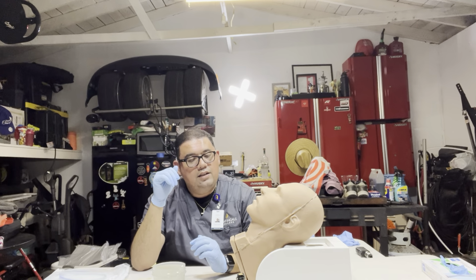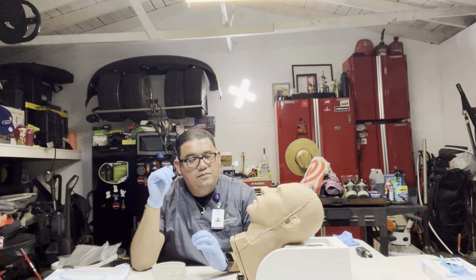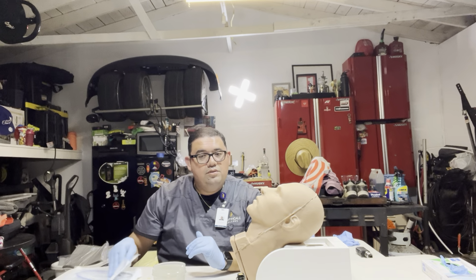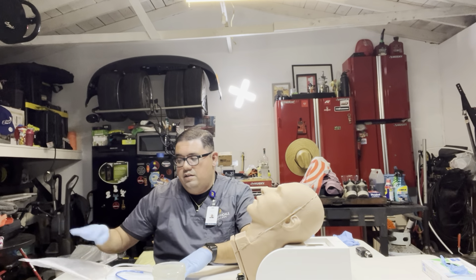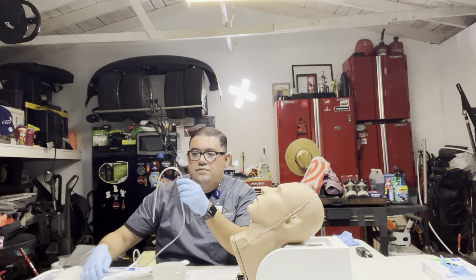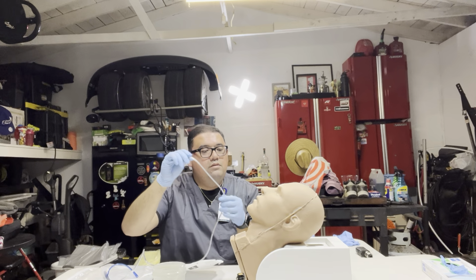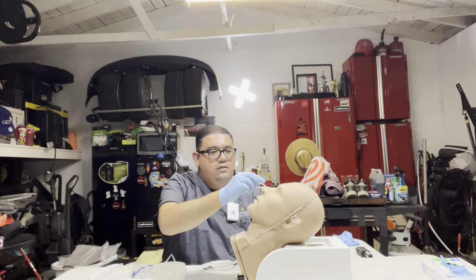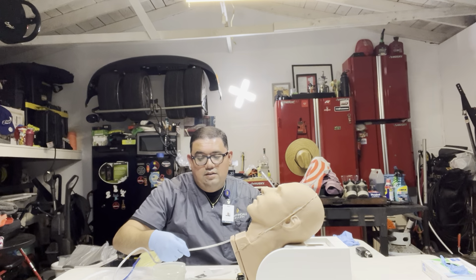I'm going to use your right nostril. I'm going to go ahead now and take the NG tube and measure it. Make sure I have the proper length for you, okay? So I'm gonna start from the tip of your nose to the earlobe to your xiphoid process.